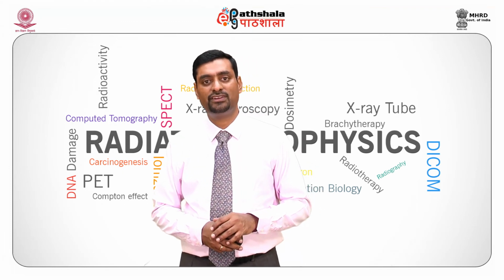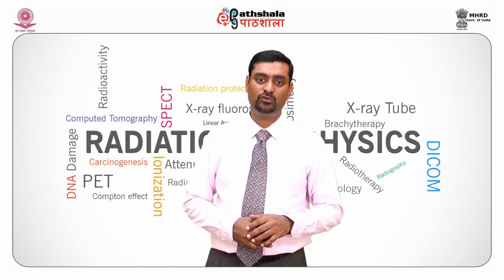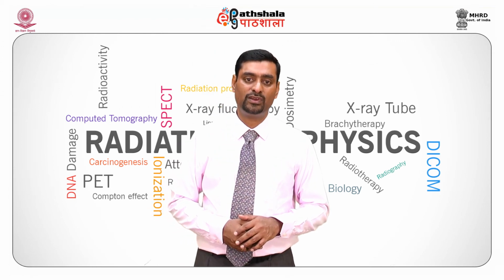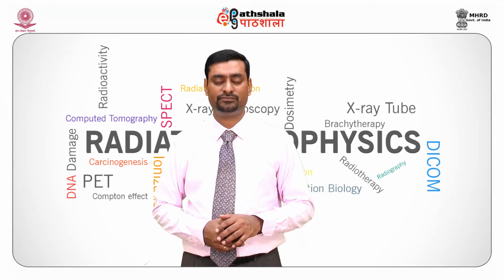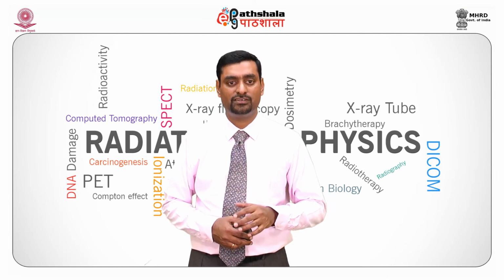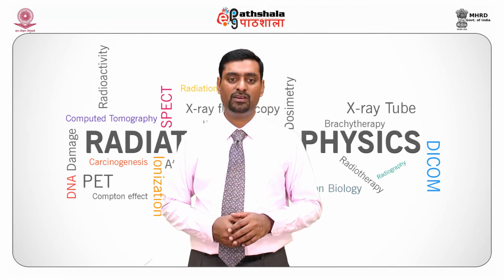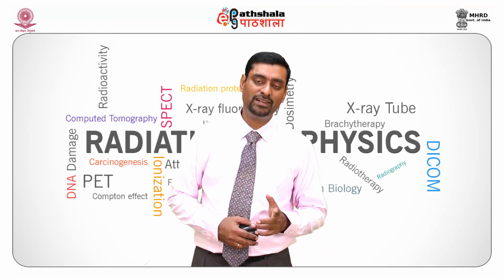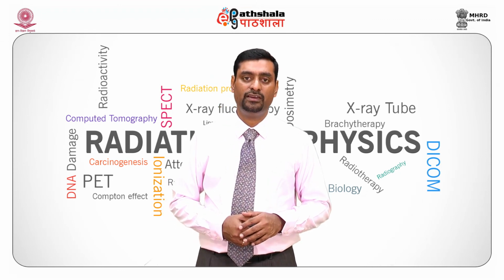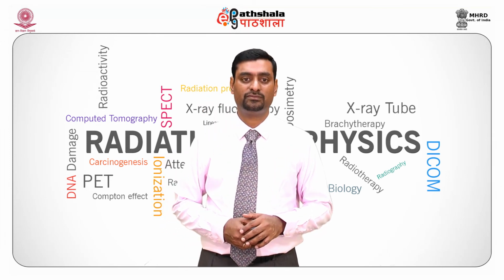Let us summarize what we have looked through in this module. Film screen radiography uses a light-tight cassette containing film and fluorescent material to record an image using X-rays. Film is the recording medium, or it is a detector. When film is exposed to X-rays, chemical compounds in the film undergo subtle changes to form a latent image. When film is processed using chemicals, it is possible to visualize the invisible image as a visible image.